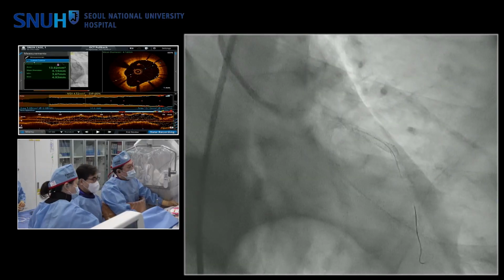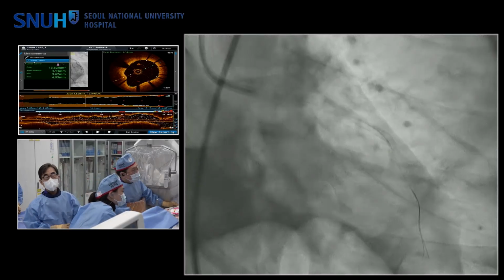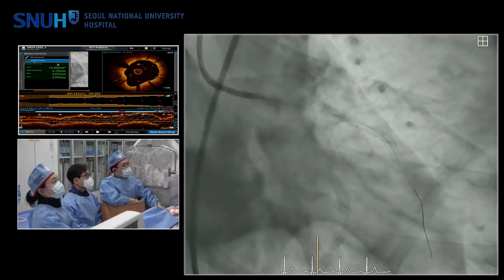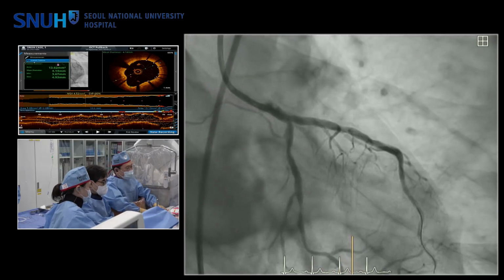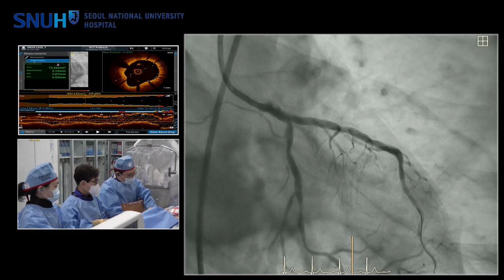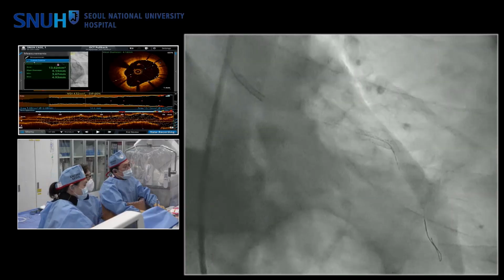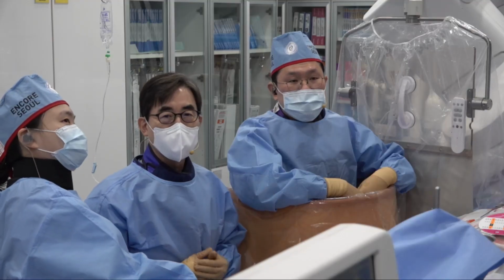Extensive calcification from distal left main to mid LAD can be easily treated with just one balloon of IVL. Still, I'm wondering what would be the result of the cutting balloon. We are exploring all the cases in Korea, and we'll have more experience next year. I was enthusiastic about the cutting balloon about 10 years ago. Now I try to forget its presence because it was always disappointing.